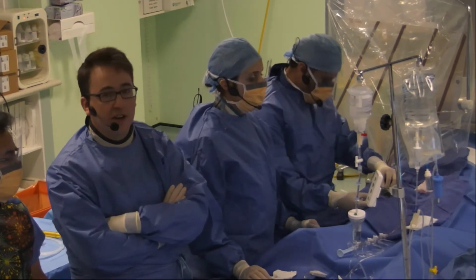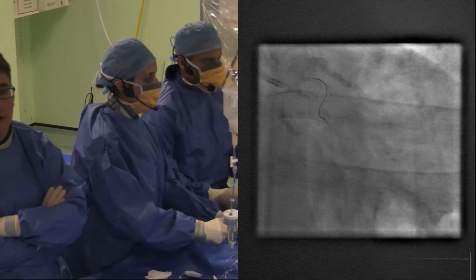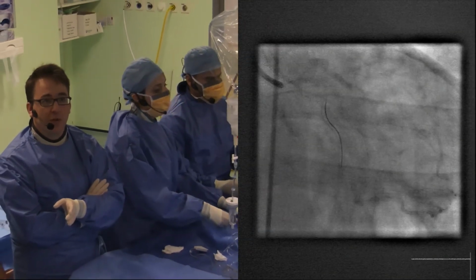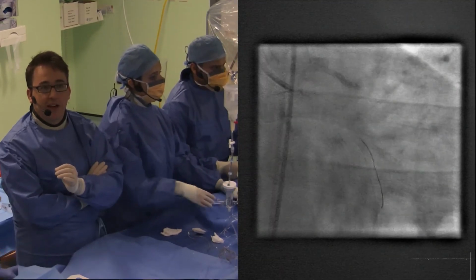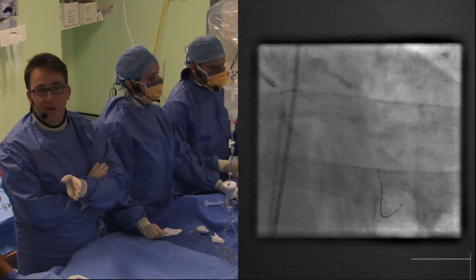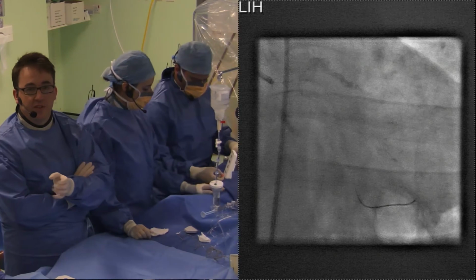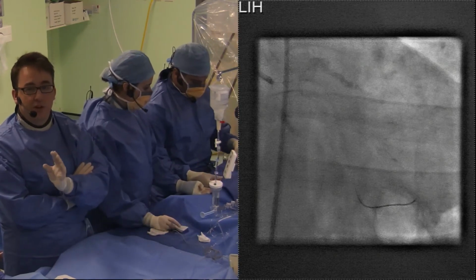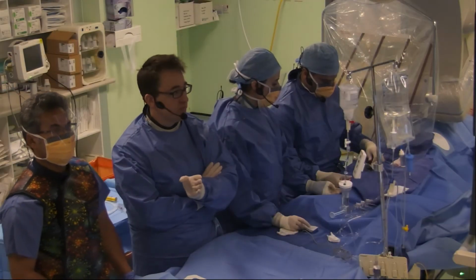Of course, in the old days, before FAME and FAME 2, the threshold here would have been very, very low to make an insertion of a stent in this case. Of course, we now know that really the principal reason for stenting intermediate and even moderate lesions is really to help improve angina. We know stenting intermediate lesions is not necessarily going to help us with clinical outcomes. So we need to ensure critically that we have a lesion which has ischemia generating potential.